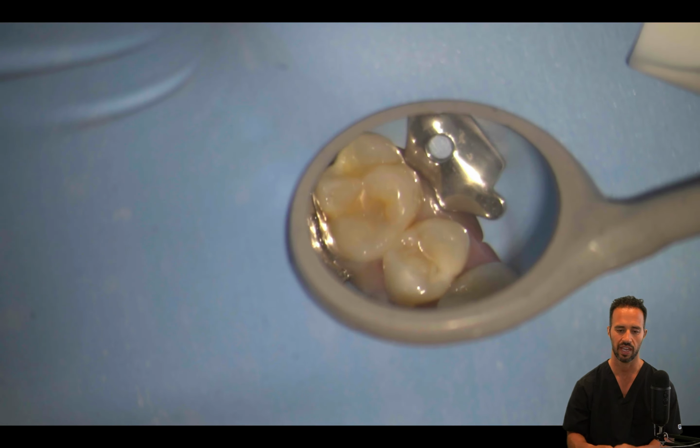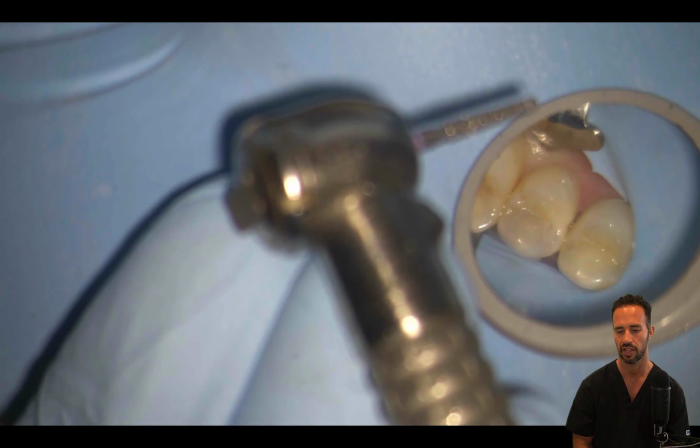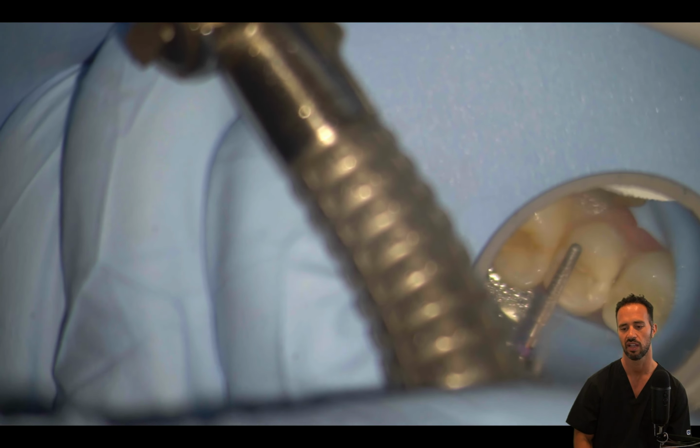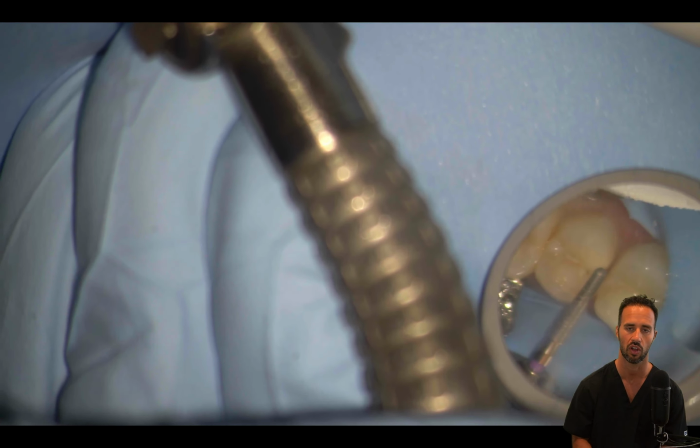Again, this is so great to utilize the split dam when you have that large carious lesion, so that your burr doesn't get snagged up in the rubber dam. That's a very startling event to the patient, and you want to avoid that at all costs.